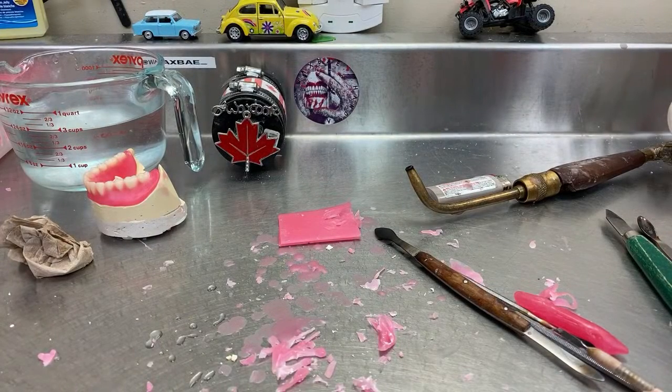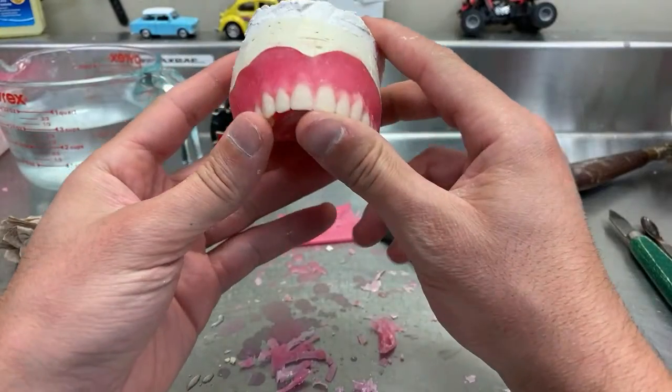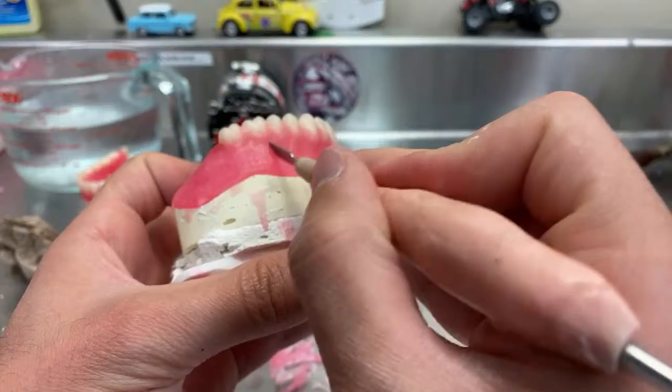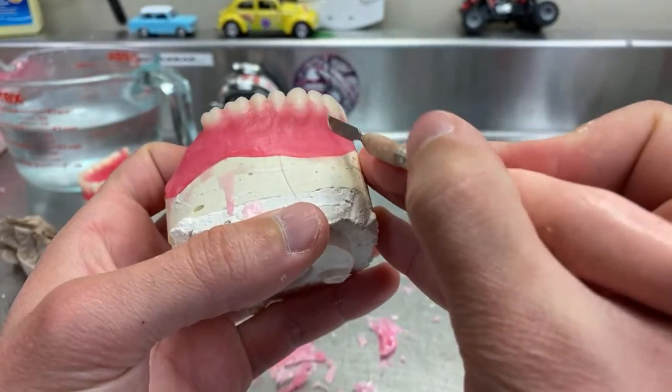So yeah, not going to be spending too much time on that because I'm just trying to show you the technique. And right now, I'm going to try to remove it off the model by soaking it in water.